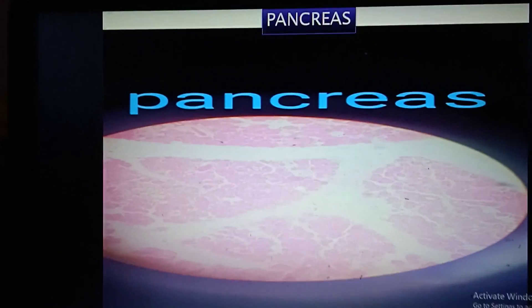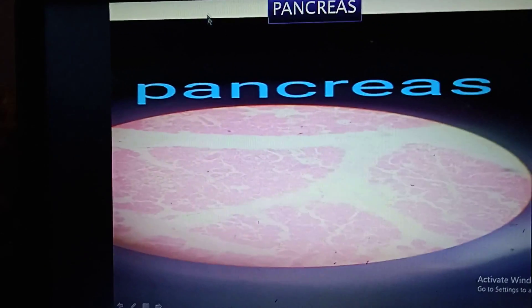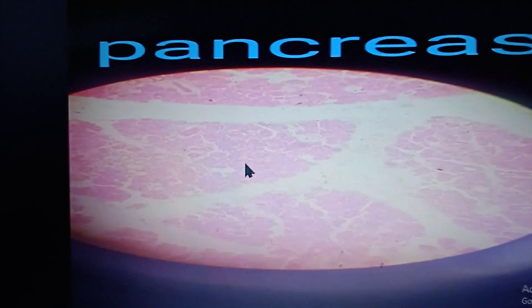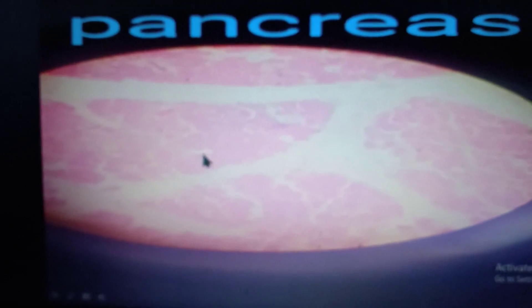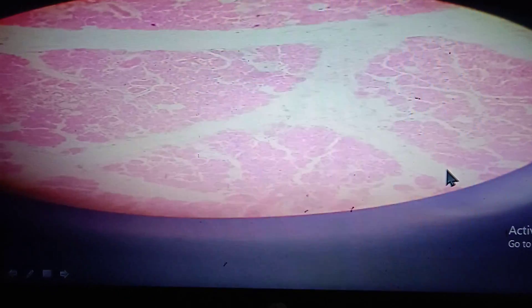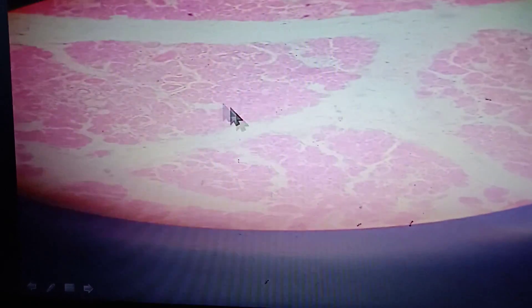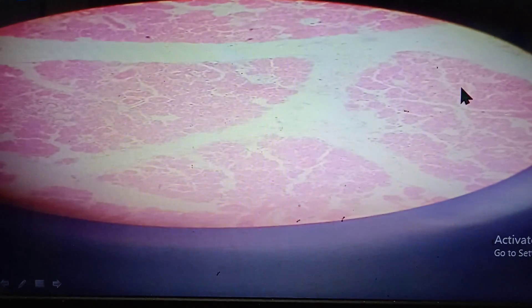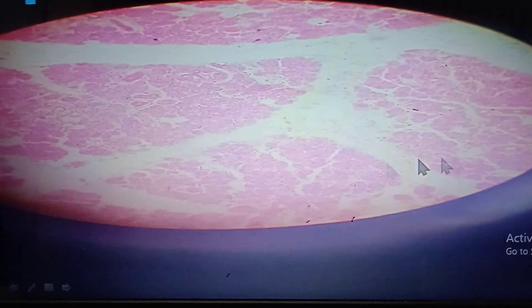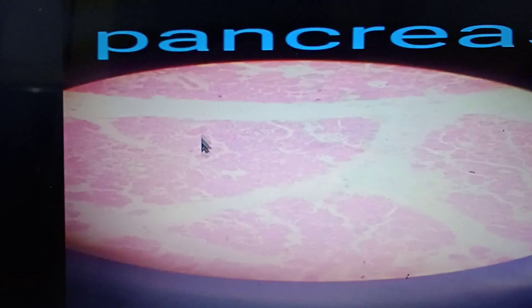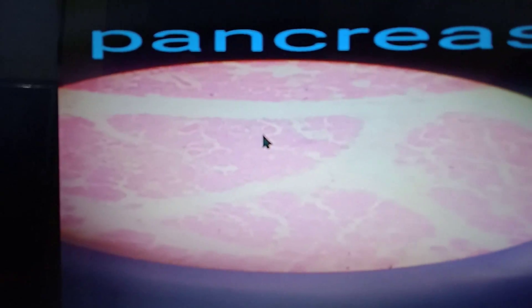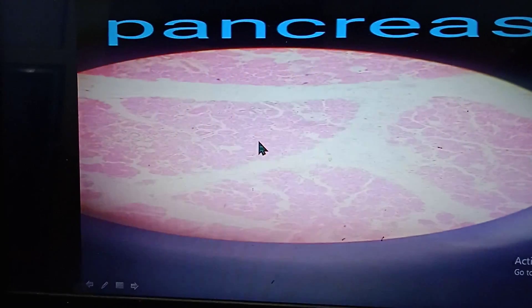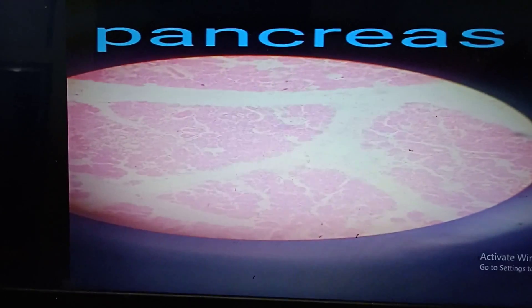This is the pancreas, which is both an exocrine and endocrine gland. It is evidenced by the presence of islets of Langerhans — light pink structures scattered in between the exocrine acini. There is no striated duct, which is found in the parotid.